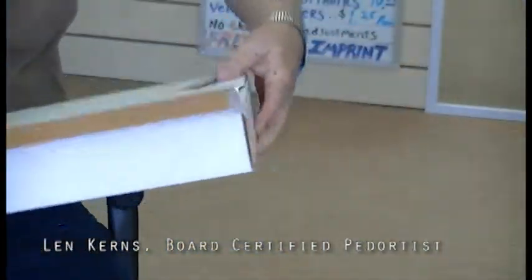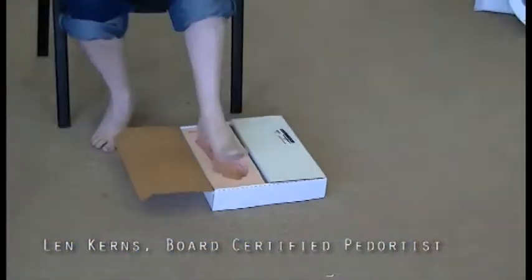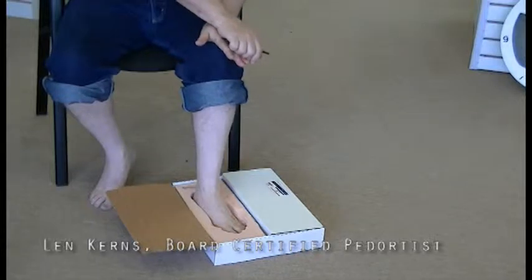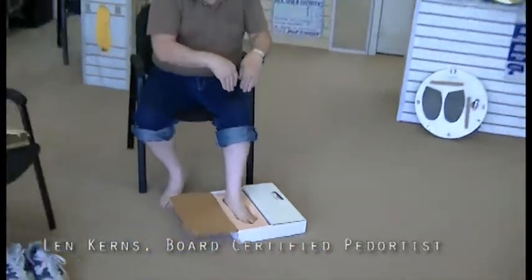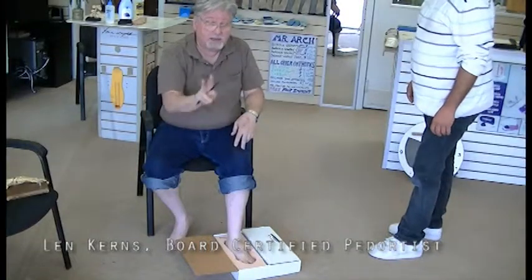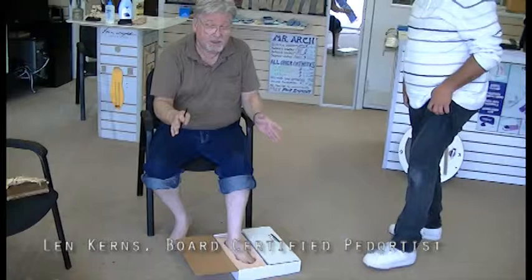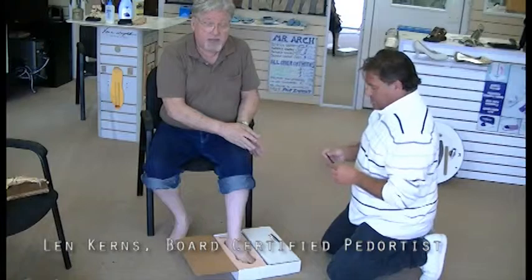At this point, Mark or you can put the foam down, gently put my foot into the box, turn it clockwise, counterclockwise, get it in neutral, put the palm of your hand down, and push it the extra half inch. But the problem is to check this one first. Because every week I get a doctor sending me in two bad casts who went to college for 8 years. Foot doctors. I'm not even talking about chiropractors. Who somehow managed to be very busy. They know what they're doing, but they just don't look. So please, look at the first foot you cast. And if you see, try to correct your mistakes so that when you do the right one.